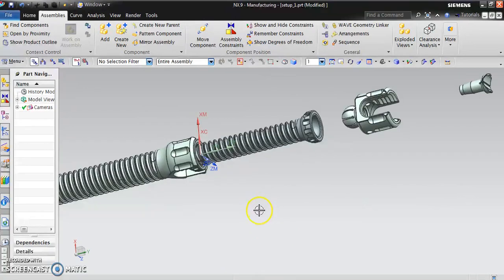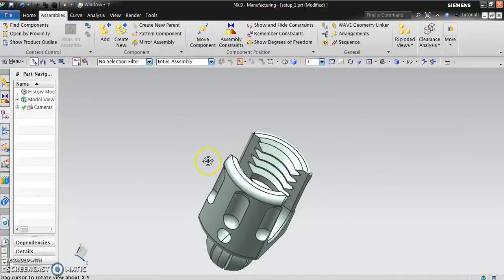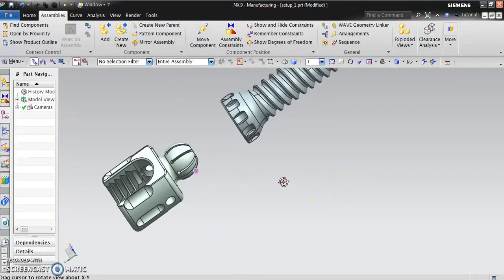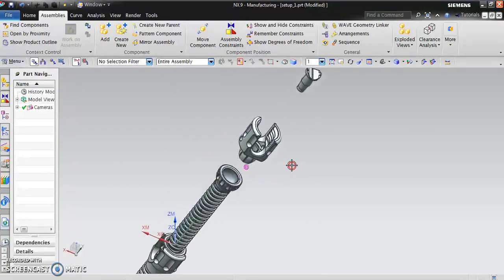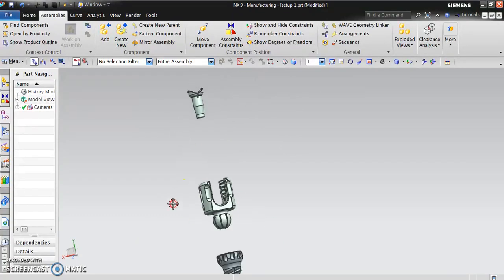The system you're looking at here will have a pedicle screw, a spinal hook and a rod system. Then there will be a set screw that comes in, and once the rods are put in through here, the set screw will come and lock it. Now let's look at how these implants are manufactured.